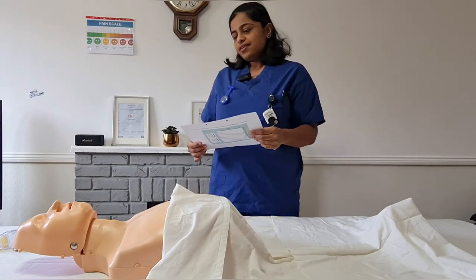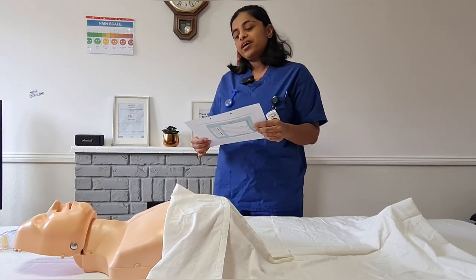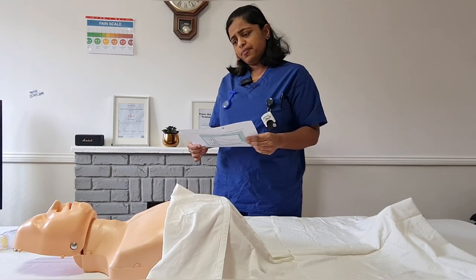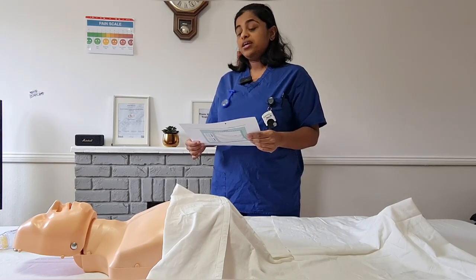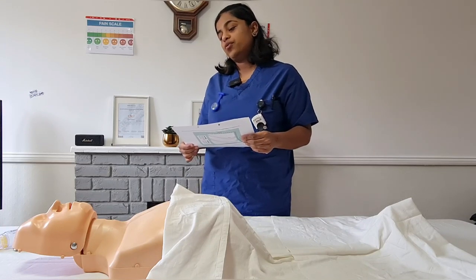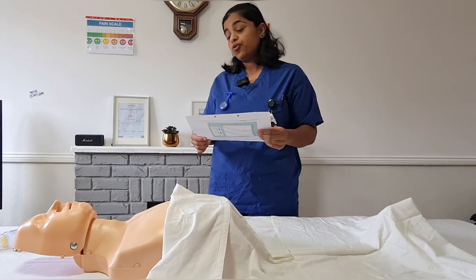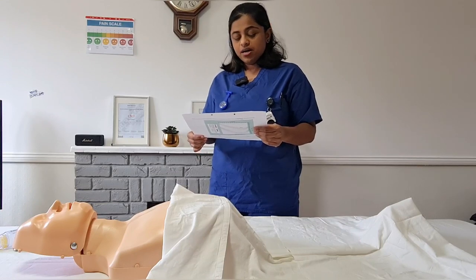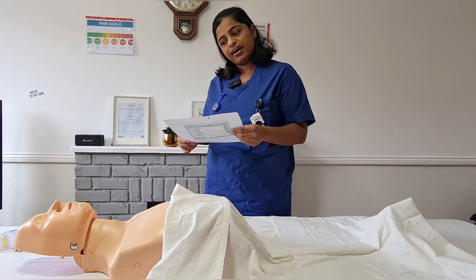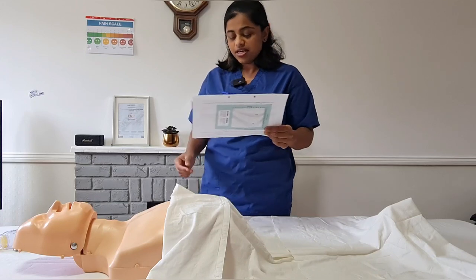Hello Emma, how are you doing today? My name is Sasha Sebastian, I am the nurse looking after you today. Are you comfortable Emma? I am here to give you an inhaler which is due at 14:00 hours. It is today and it is 14:00 hours now, so I will give you your inhaler now. Is that alright?